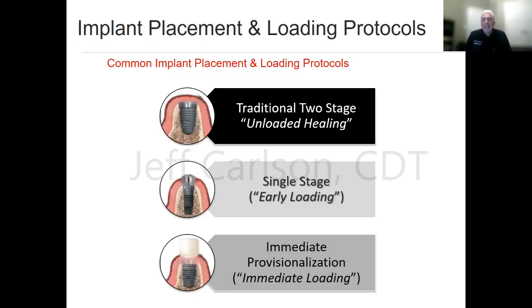How long is the implant? How wide is the implant? These are all things that you always need to check before you say, hey, I'm going to do an immediate load case. As desirable as it could be, there are limitations to it.